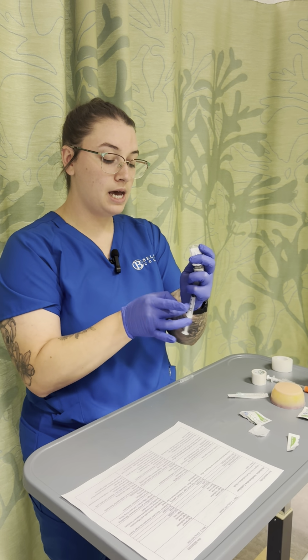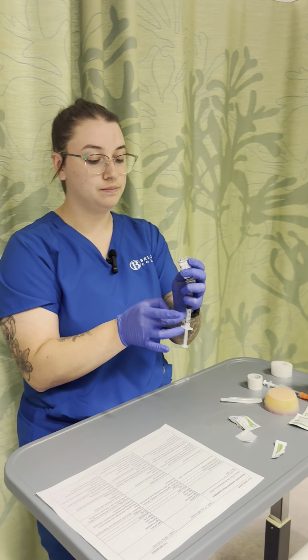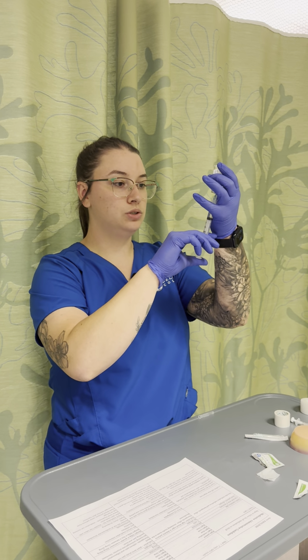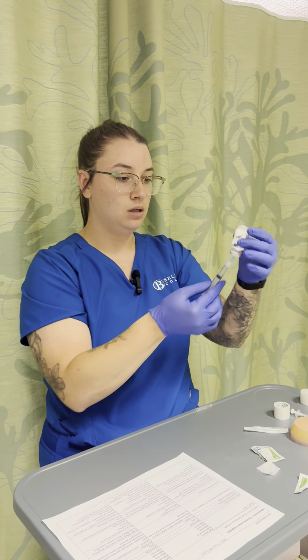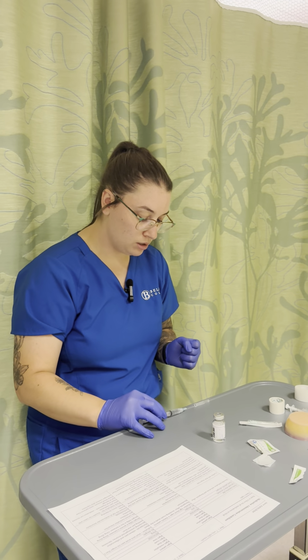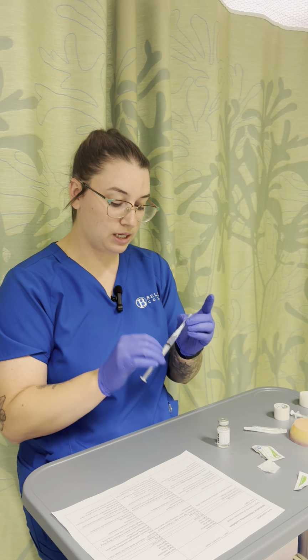I'm going to tap my syringe, make sure there are no air bubbles. And then making sure I'm exactly at 1.3. And going to slowly withdraw. Recap my needle. Make sure I hear that click.